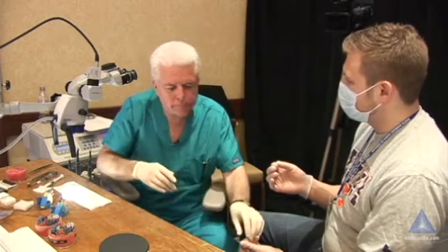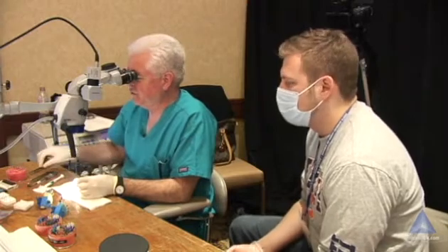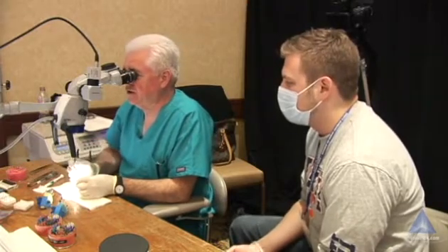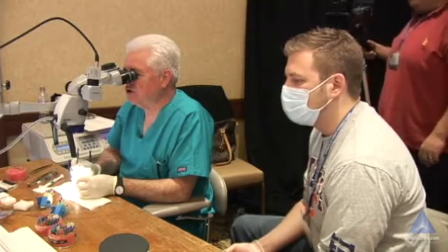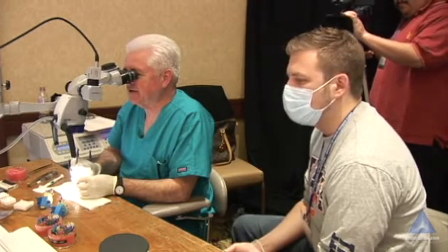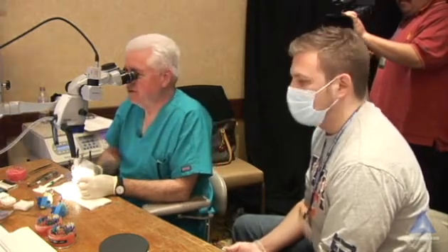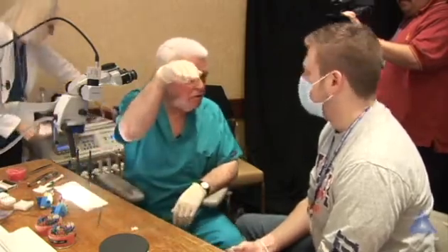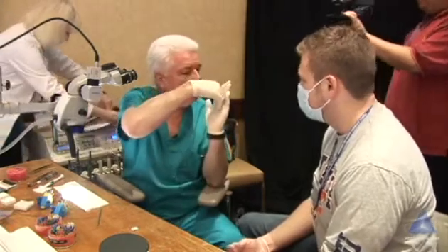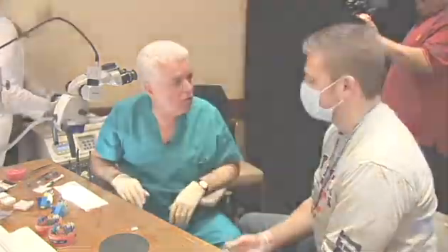So in this instance, I wouldn't put in viscous chelator right now, because then you'll try to find the MB2, and you'll go, well hell, I can't find it — the viscous chelator's blocking me. So we could just ignore these, and if you're going to sit out here, I'd like to see you flare this more, right now, immediately. Because then when you put in viscous chelator, you don't have to see anything. You just hug that MB line angle, slide down a smooth axial wall, transition into a pre-flared orifice, and now you're carrying your viscous chelator in — and it's all a lot easier.